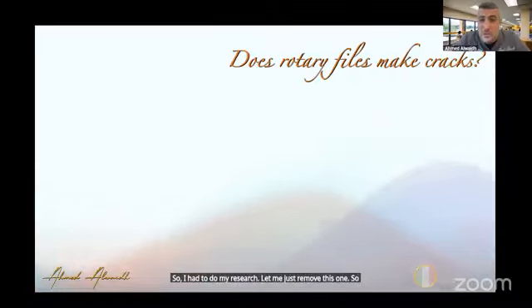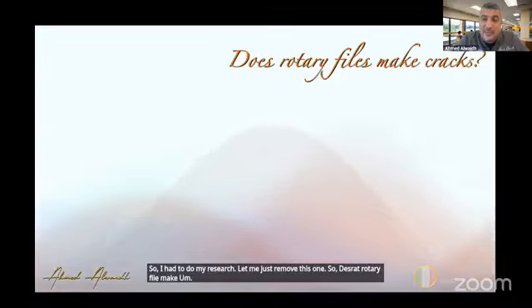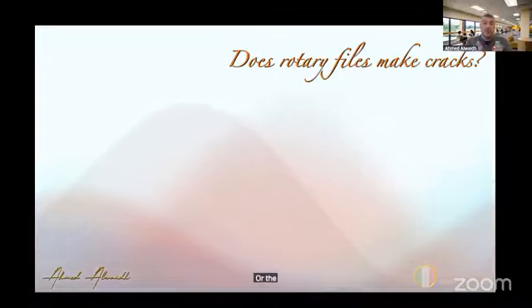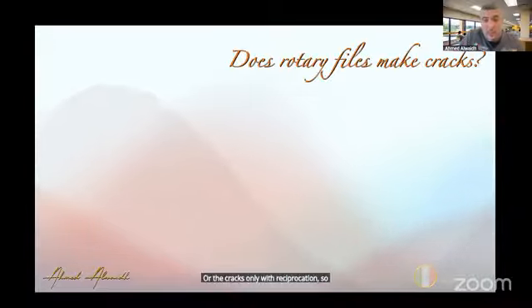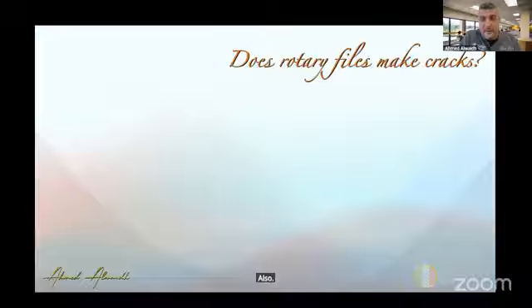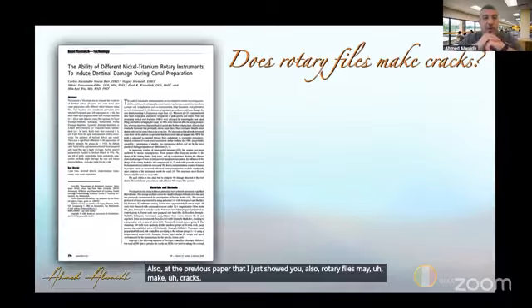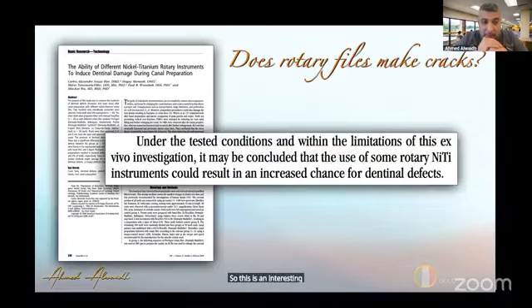So do rotary files make cracks, or are the cracks only with reciprocation? So we need to look, because according to that paper, also the previous paper that I just showed you, rotary files may make cracks. So this is an interesting paper, okay?